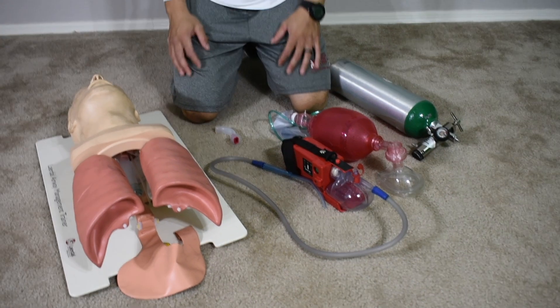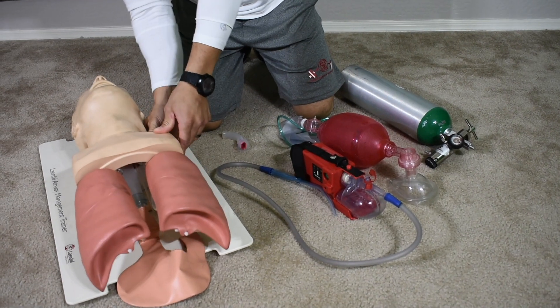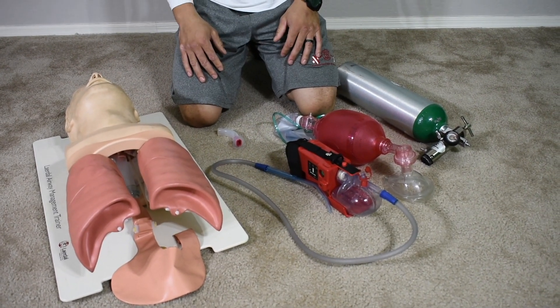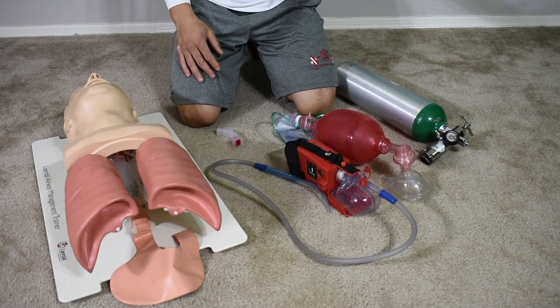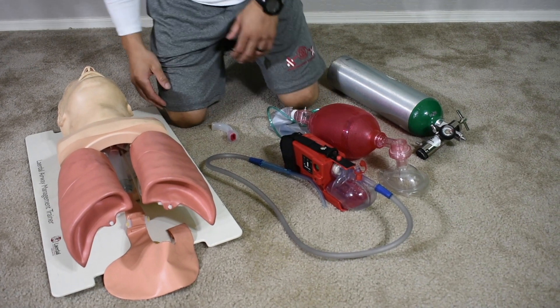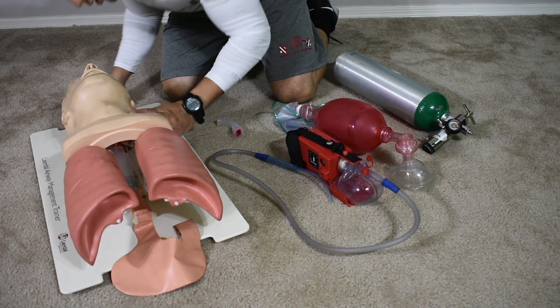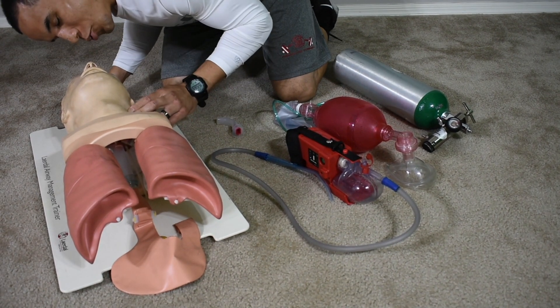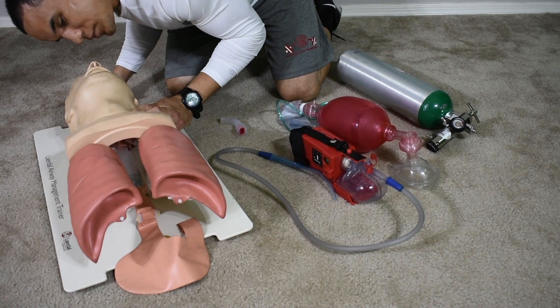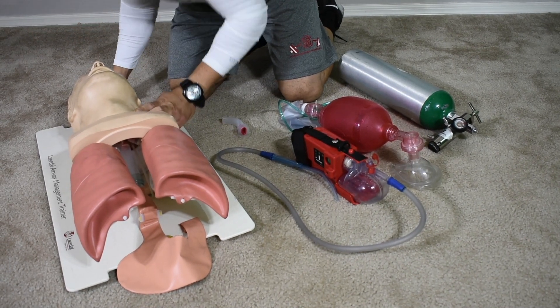BSI scene safety. Sir, what's going on? Patient is unresponsive. We're going to request additional ALS and transport. I'm going to assess for carotid pulse and look for breathing for no more than 10 seconds. The patient is apneic and has a weak pulse of 60.